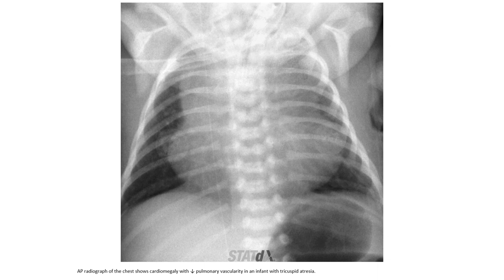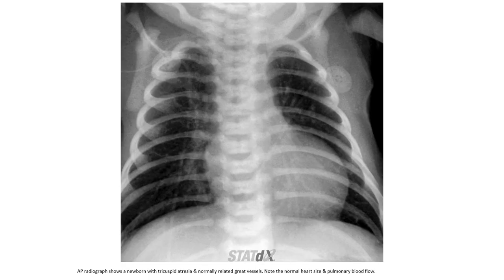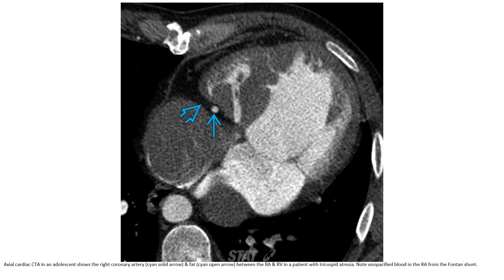AP radiograph of the chest shows cardiomegaly with decreased pulmonary vascularity in an infant with tricuspid atresia. Another AP radiograph shows a newborn with tricuspid atresia and normally related great vessels — note the normal heart size and diminished pulmonary blood flow. CTA in an adolescent shows the right coronary artery and fat between the right atrium and the right ventricle in a patient with tricuspid atresia, with unopacified blood in the right atrium from a patent shunt.